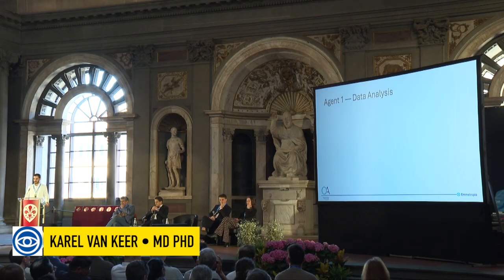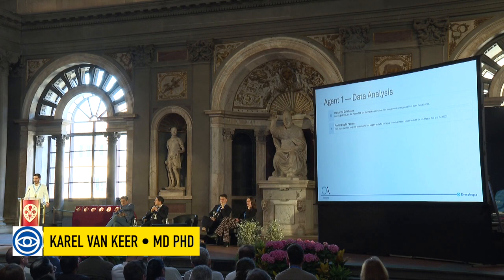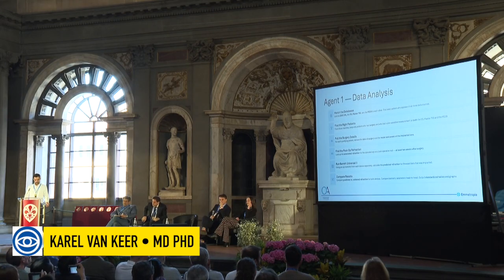Data analysis: I had 3 different data sources, a raw export of all my patients, of the IOLMaster 700 and the MS-39. Then I said to match all those patients, to find the patients who had surgery and who had received both IOLMaster 700 and MS-39, to pull the surgery details, date of surgery, type of lens implanted, power of the lens, then find the post-op refraction at least 2 weeks after surgery, run automatically the Barrett Universal 2 formula for both devices, and then compare the results between the 2 devices.